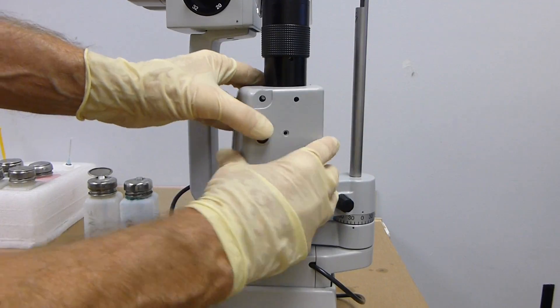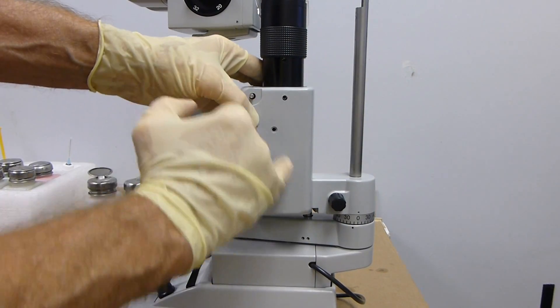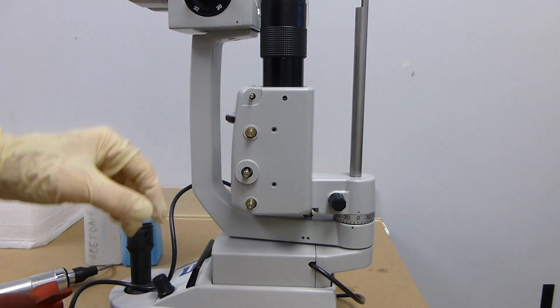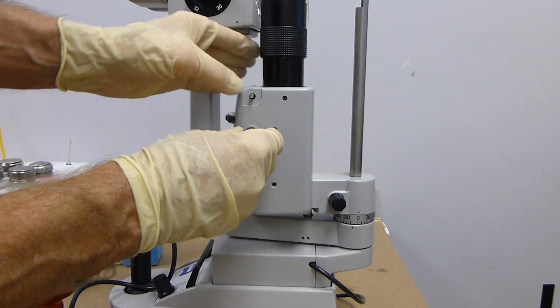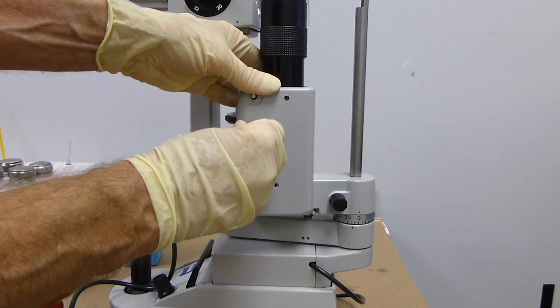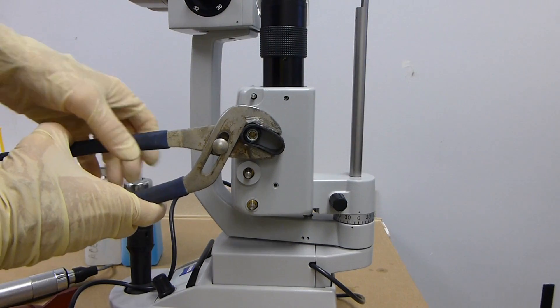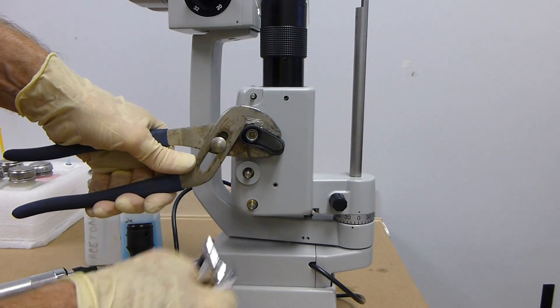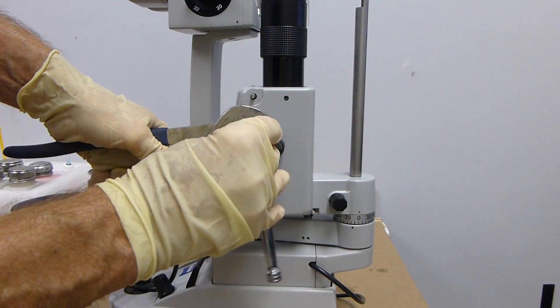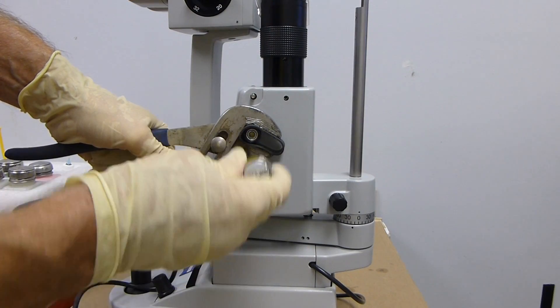Put it back together. Put your cover on, put your Allens in, and then put your knobs on. Just like you took them off, you have to hold them while you tighten the nut inside.